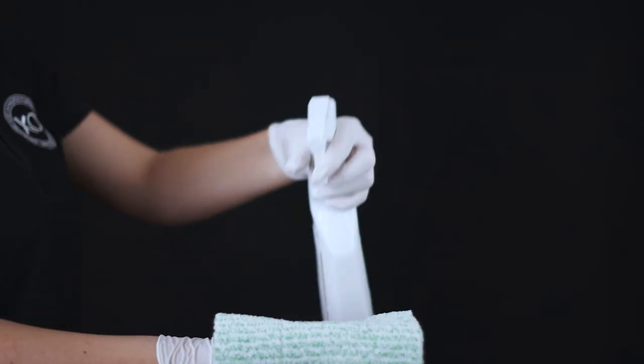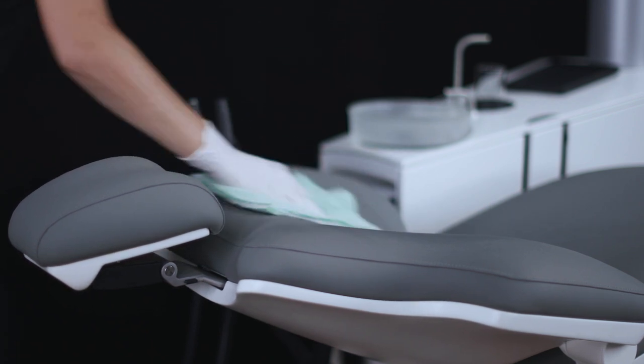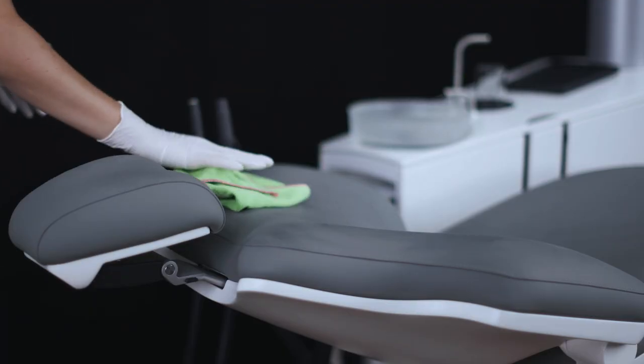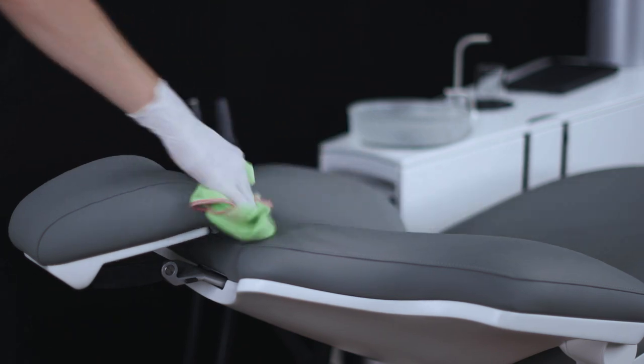If you notice any stains, apply XO Fabric Makeup to a dry lint-free cloth and remove stains as soon as possible. Wipe off the residue of XO Fabric Makeup with a dry cloth when finished.